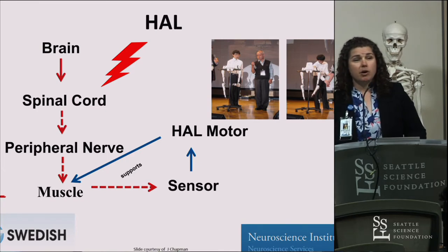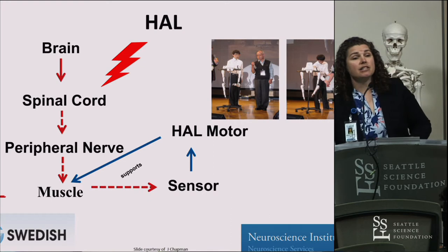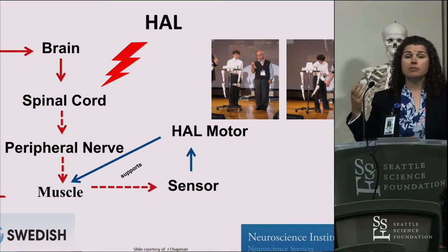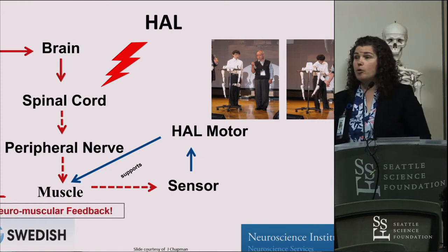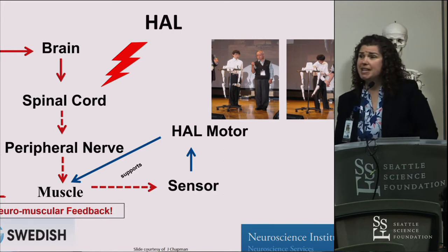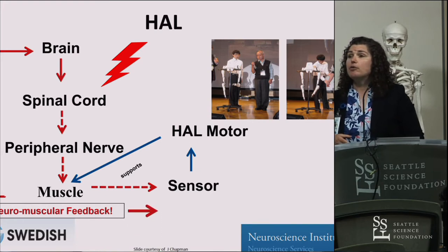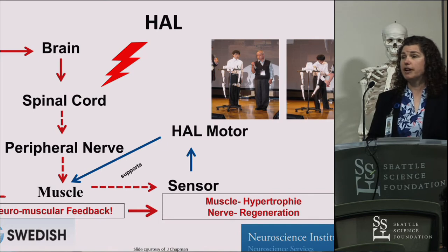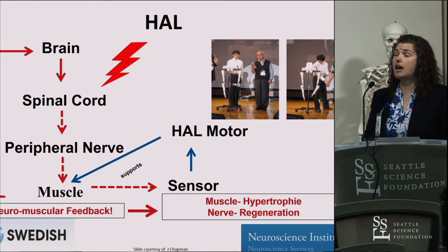So that's wonderful, because here you've got this great feedback loop where the brain is telling the body, I want to bend my elbow, and then the robot is helping the elbow bend, and the brain is getting the feedback, yes, what I just tried to do created this movement. And so that leads to a lot more neuroplasticity than a passive robot. And you still get all the benefit of being able to get so many repetitions, because the robot is assisting and the therapist isn't having to do it all. And then peripherally, of course, this can lead to stronger muscles and potential nerve regeneration. So this is really exciting and really, really different.